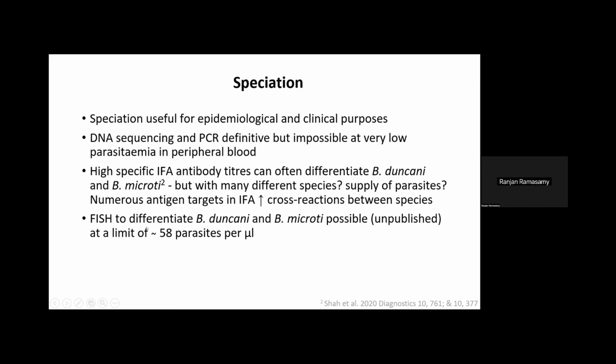We have, in IDFISH, developed a FISH test that we think can differentiate Babesia duncani and microti at this sort of limit of detection. But this work needs a bit more work before it can be published and shared publicly.